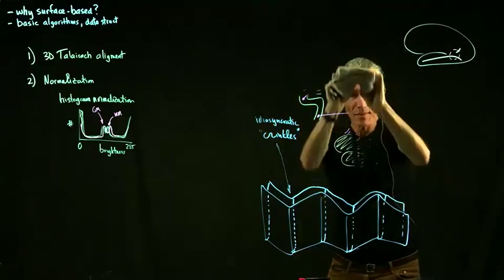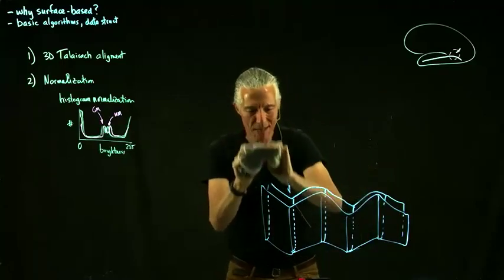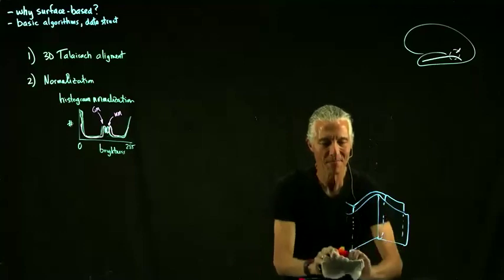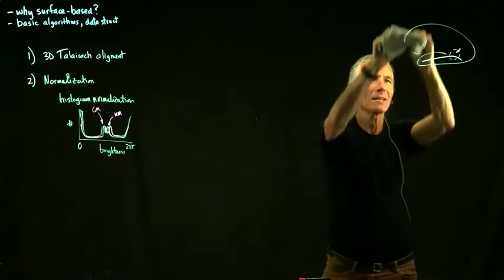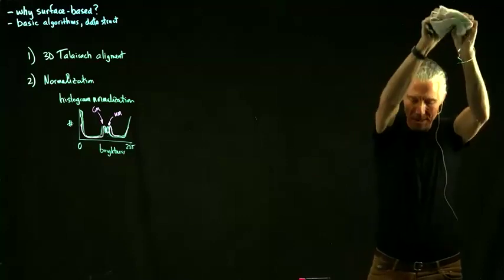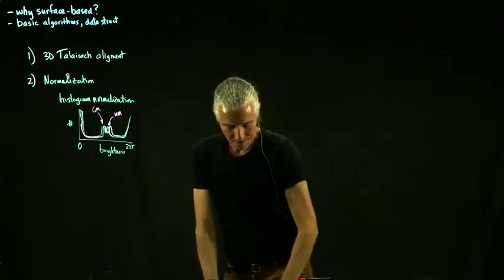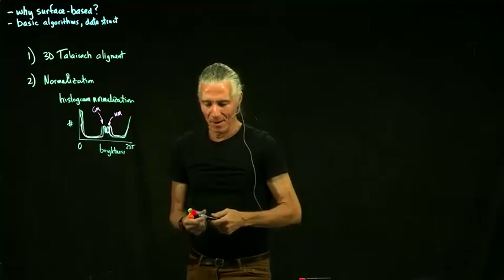So after we've done that, we face another problem immediately, which is, how do you get rid of the skull? Because if we look at the brain, just a human looking at the brain, no problem. You can easily see where the brain is. But how do we actually get rid of the skull? And what are we talking about getting rid of?